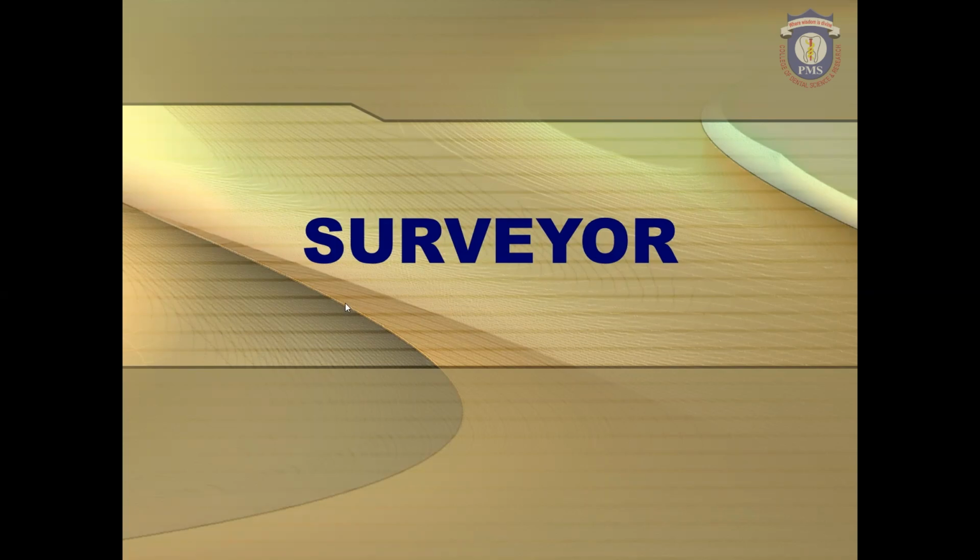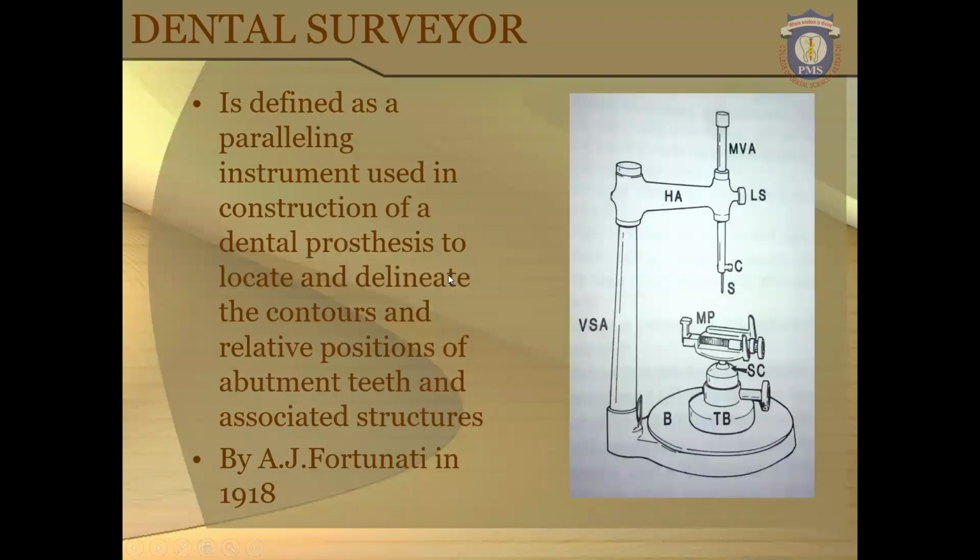Basically, it is a paralleling instrument. Dental surveyor is defined as a paralleling instrument used in the construction of a dental prosthesis to locate and delineate the contours and relative positions of abutment teeth and associated structures.